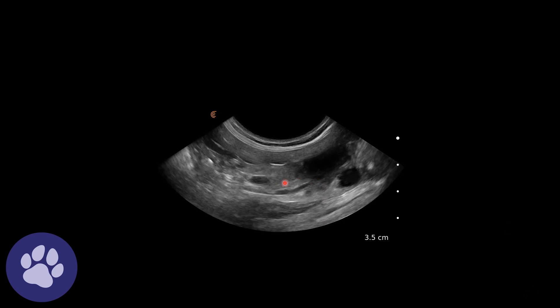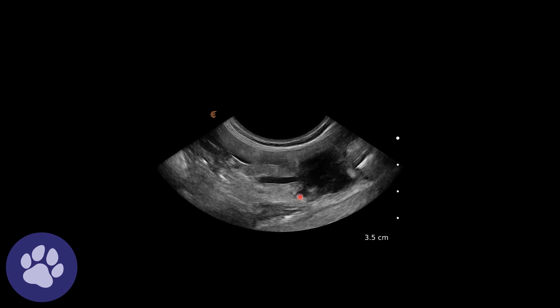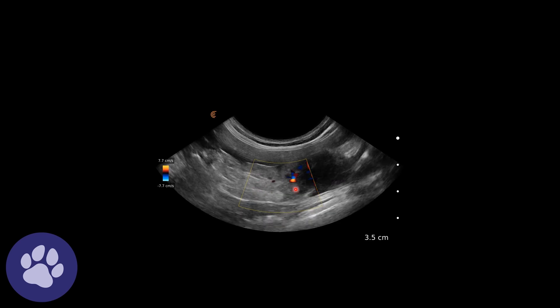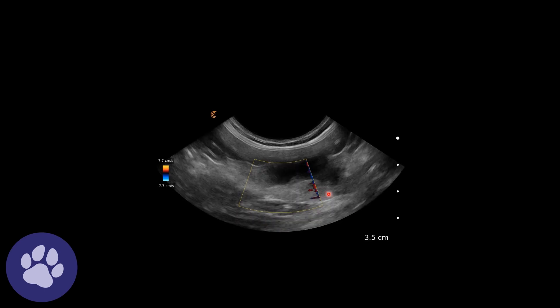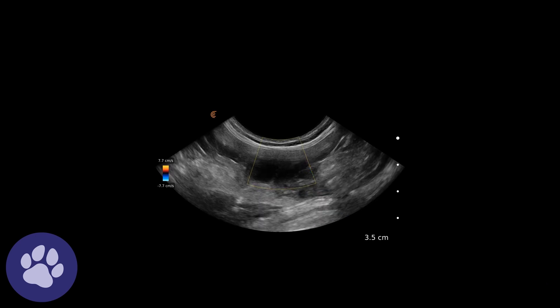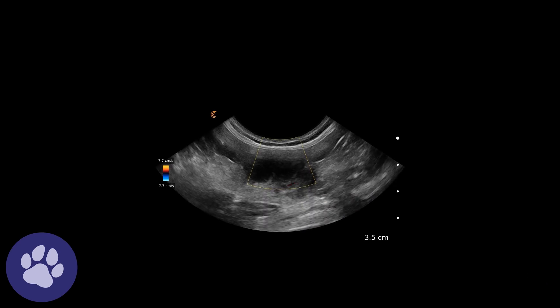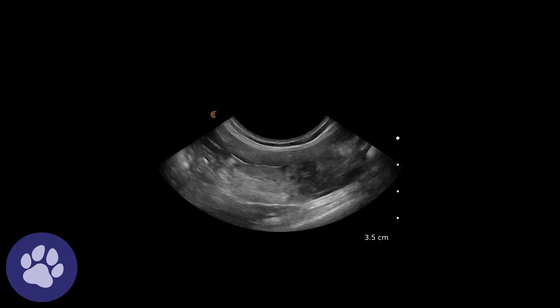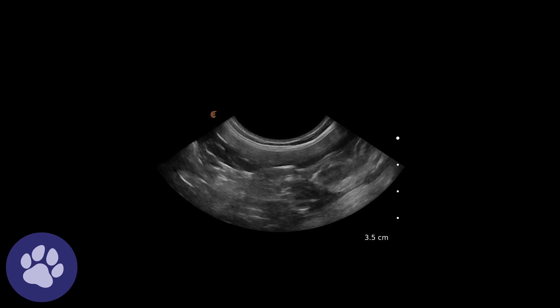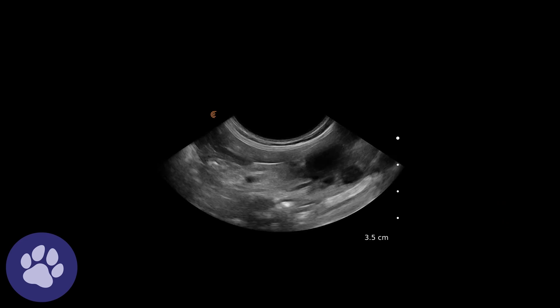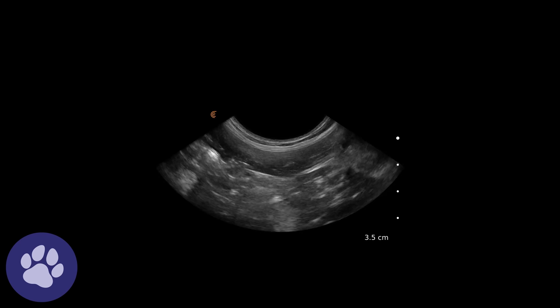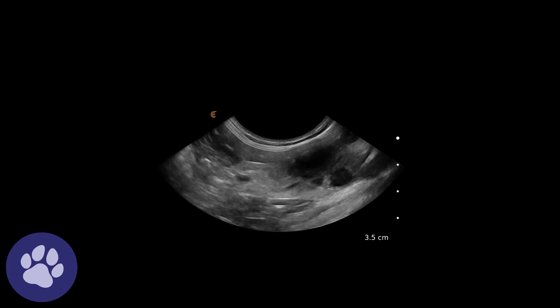This mass is heterogeneous. It has a large hypoechoic area, but also possibly some reactive fat around it. We're assessing its vascularity, thinking about taking a sample, and we don't want to stick a needle into a large blood vessel. It's essential to try and follow where the mass goes and to view it in at least two planes, trying to follow what organ it's associated with.